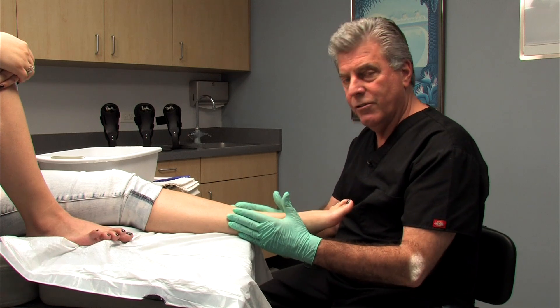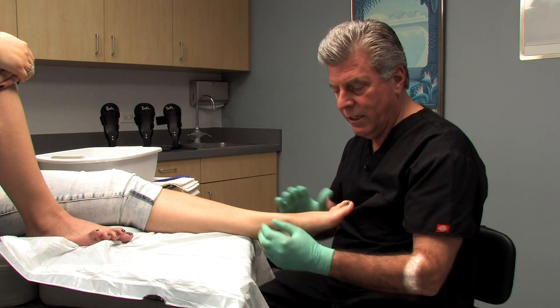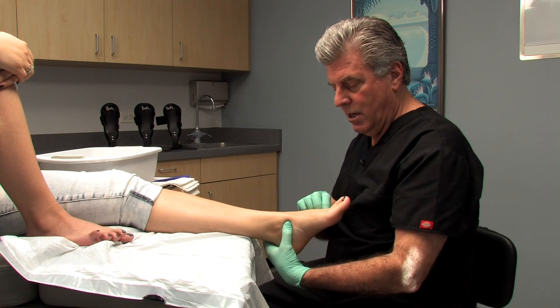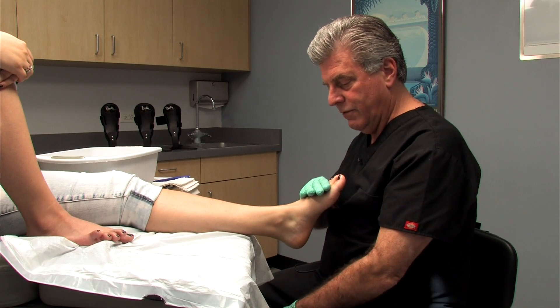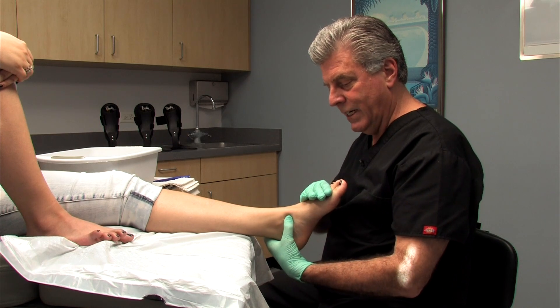Get the patient positioned so they're comfortable, so their knee is relaxed and bent slightly to relieve any tension on the gastroc and the Achilles. Get their foot positioned so that when you're ready to lift and put them in subtalar neutral, everything is relaxed and well lined up.